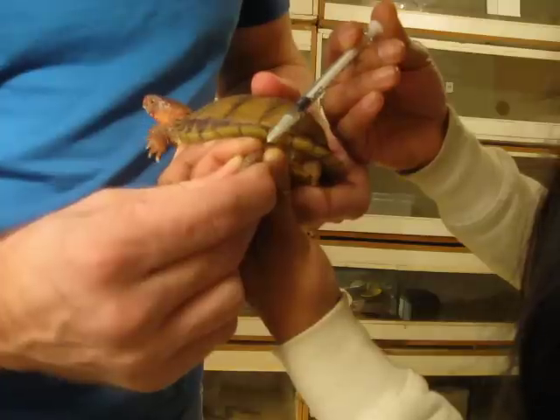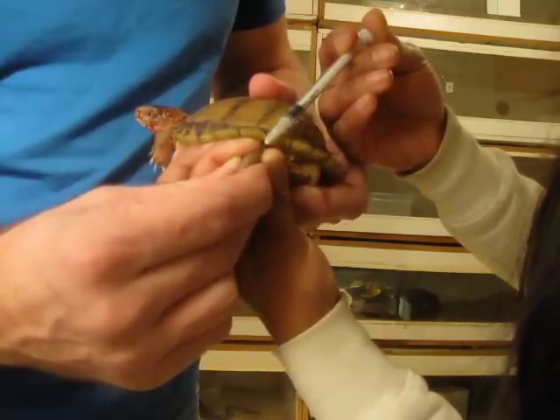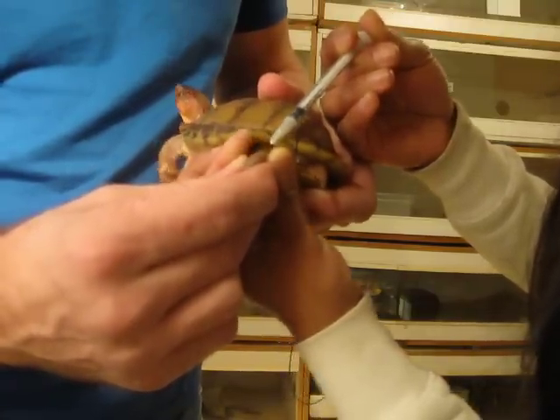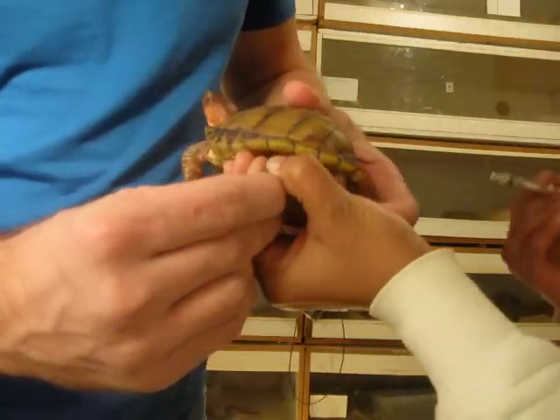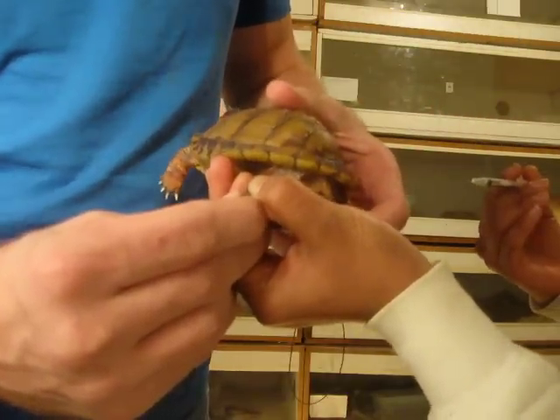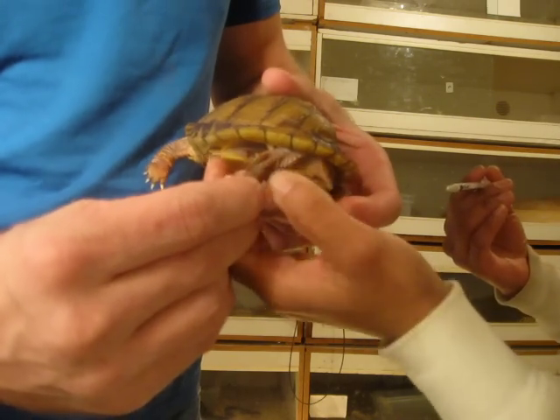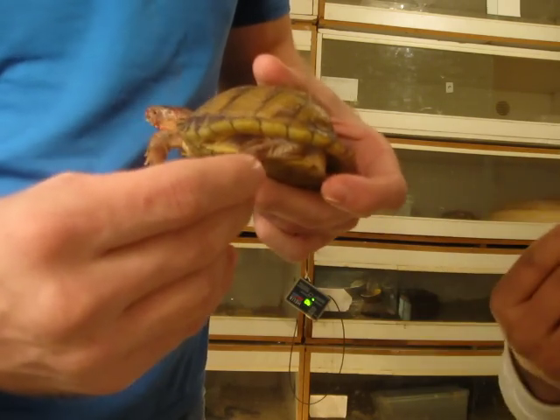There we go. Poor little guy. Just so we know, Baytril actually does hurt the animal when it goes in, so we don't like using Baytril too often. What we're doing now is covering up the hole, because if you take the syringe out right away and don't cover it up, a lot of times the Baytril will actually squirt out. So just get a little cover up there and it's done.